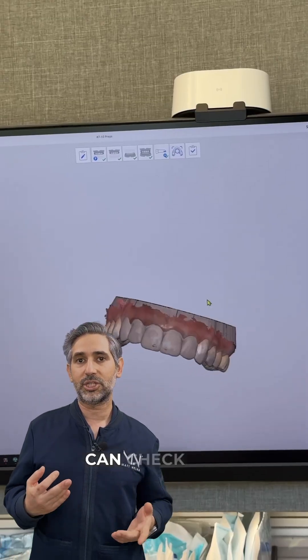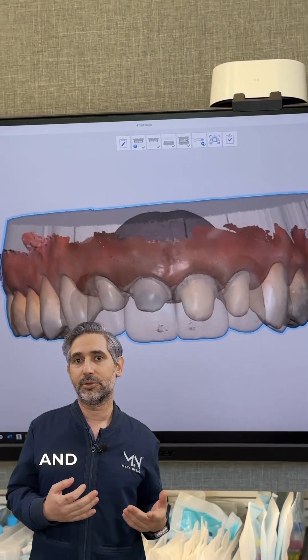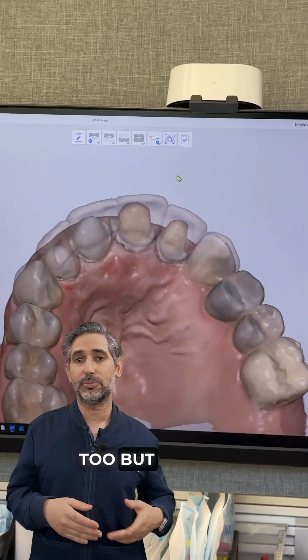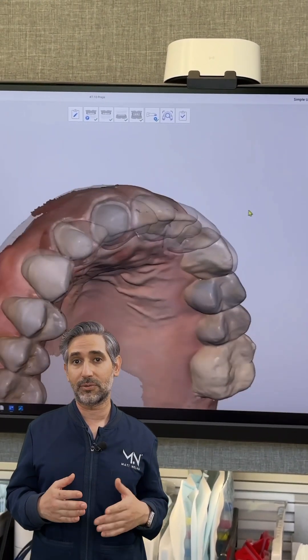That way I can check the design overlaid on top of my preps and look for adequate reduction. And if I need to make cuts, I can do that too. But there's plenty of space for this case because I was removing existing restorations.